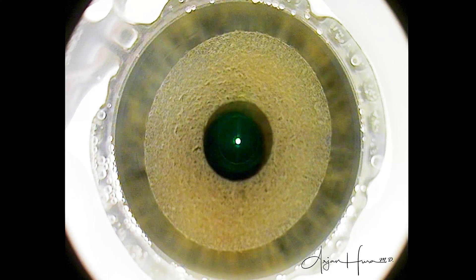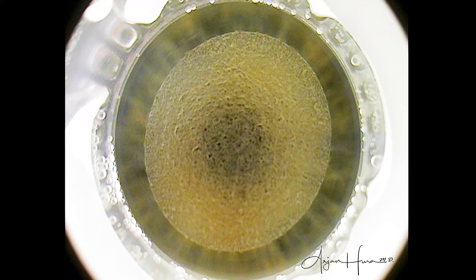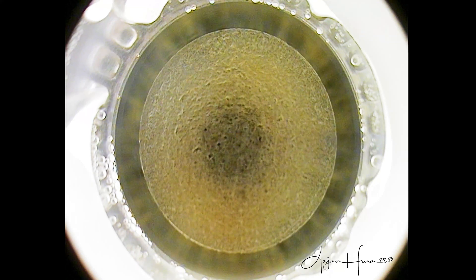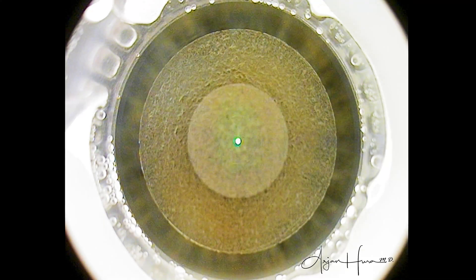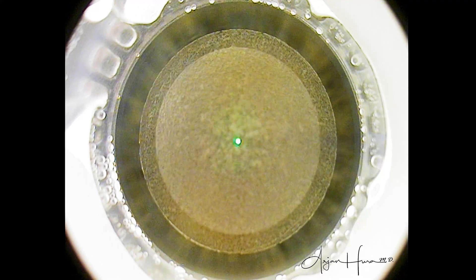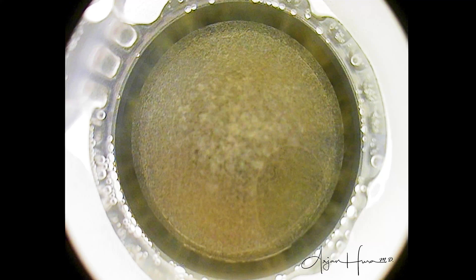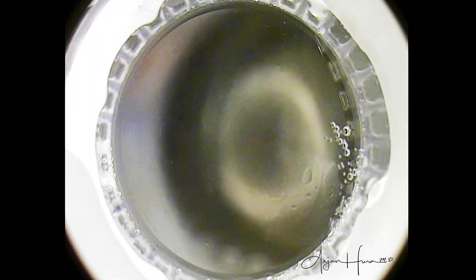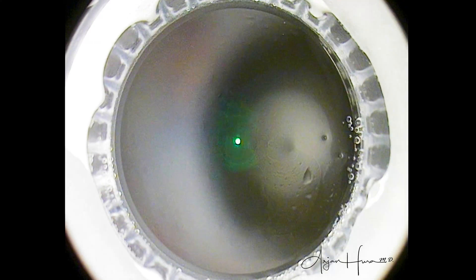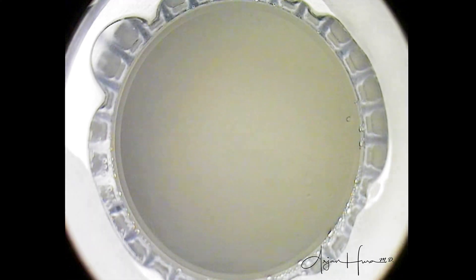So again, the outside-in cut — maximizing the amount of time the patient is seeing that green blinking light. It's really important that the patient be able to see the light for as long as possible, because that reduces the chances of a suction break. With the SMILE procedure, if a patient breaks suction, it is relatively easy to re-dock and re-establish the treatment. However, if the suction break happens during the refractive cut after the first 10%, one has to abort the treatment and convert to LASIK.